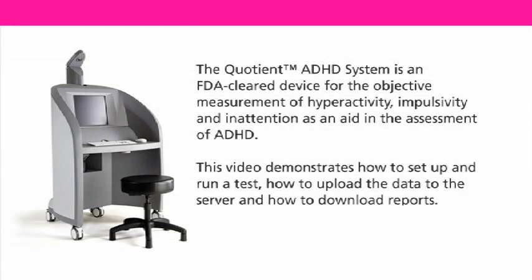The Quotient ADHD system is an FDA-cleared device for the objective measurement of hyperactivity, impulsivity, and inattention as an aid in the assessment of ADHD. This video demonstrates how to set up and run a test, how to upload the data to the server, and how to download reports.